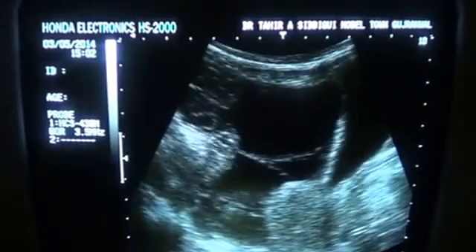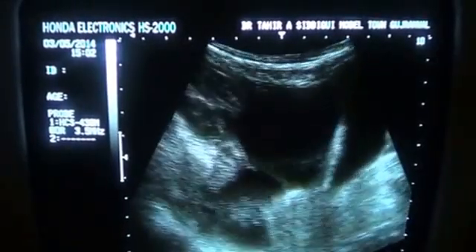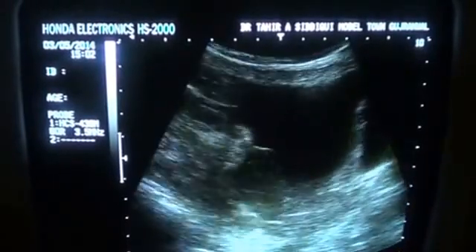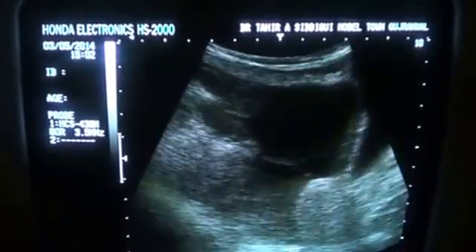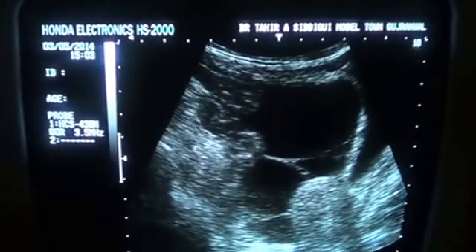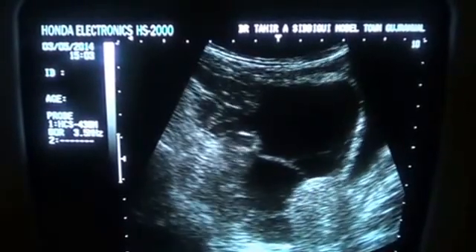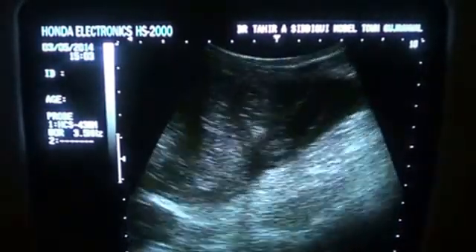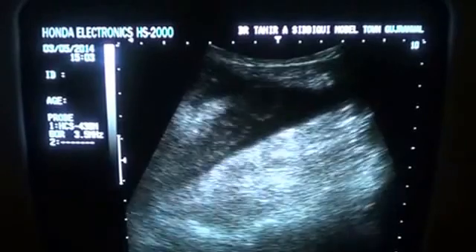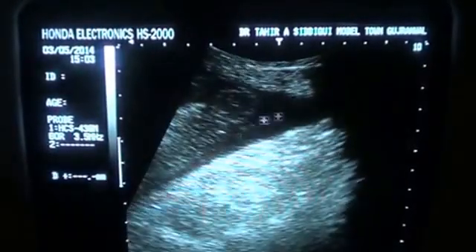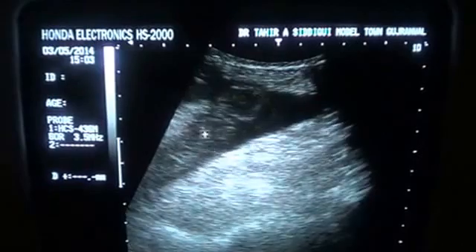So, this is a case of abdominal Koch's — until and unless proven otherwise, because all the other parameters are normal. There is only ascitic fluid. Now, this is the fluid seen in the left paracolic gutter. This is the fluid.